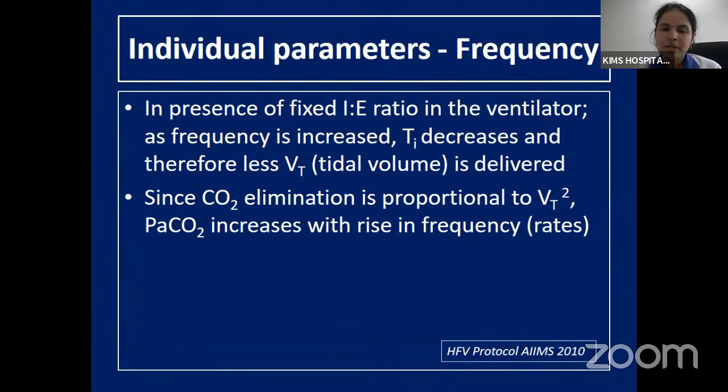In the presence of a fixed IE ratio, so typically if the inspiratory time is 33% or at an IE ratio of around 1:2, as the frequency is reduced, the I time increases, and therefore the tidal volume delivered also can be increased. So as and when the frequency increases, one must remember that the tidal volume effectively reduces, and hence this is responsible for CO2 retention.